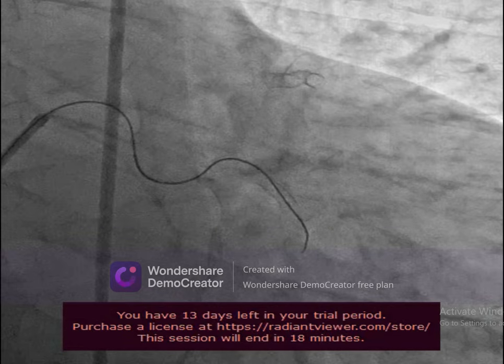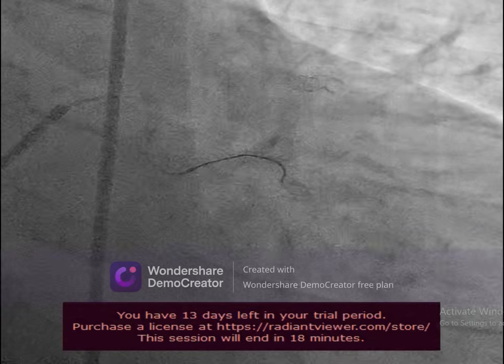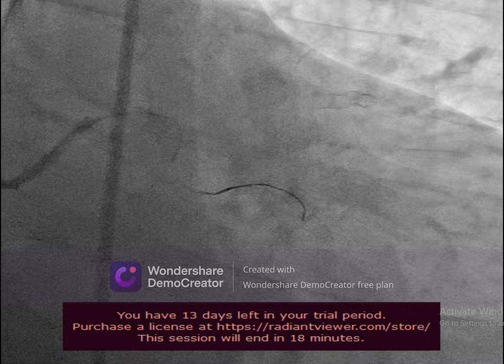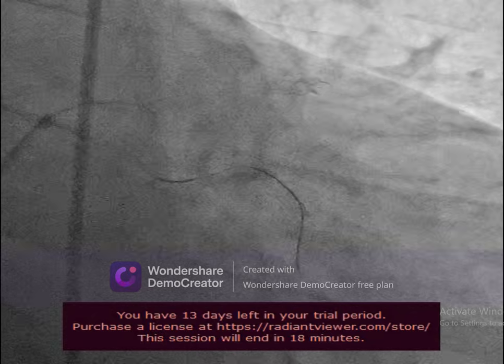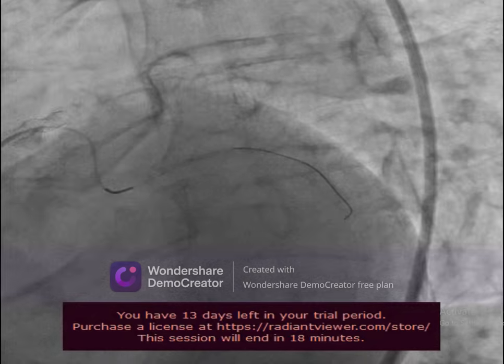But after that, I tried several times to advance the microcatheter to follow the wire, but actually it didn't pass. So I withdrew the wire and brought the PT2MS to follow the path that the Gaia Third produced by this well-controlled micro dissection, and actually the PT2MS managed to pass.